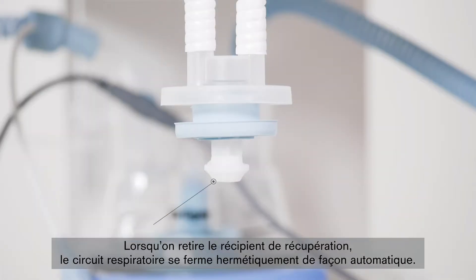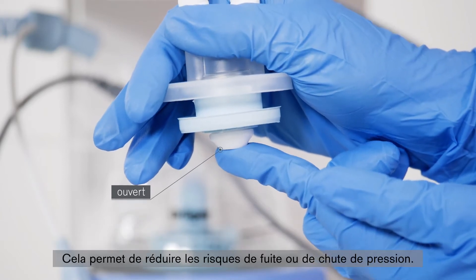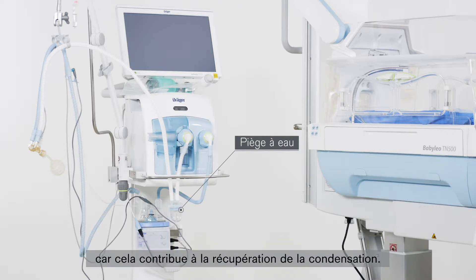When removing the collection container, the breathing circuit is automatically sealed off. This minimizes the likelihood of a leak or drop in pressure occurring. When positioning the system, always ensure that the water trap is upright and located at the lowest point. This helps in collecting condensation at this point.